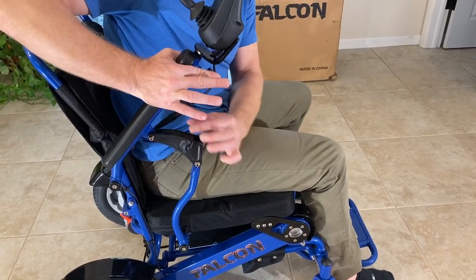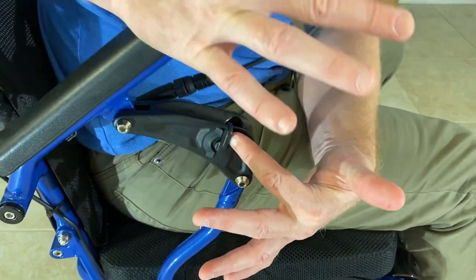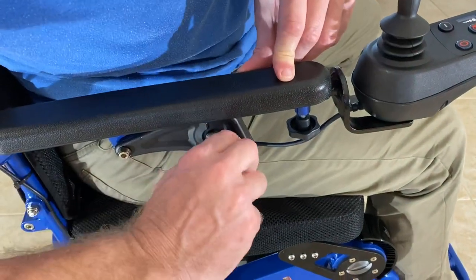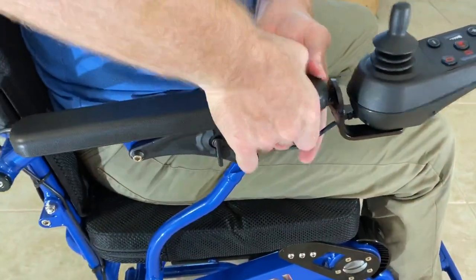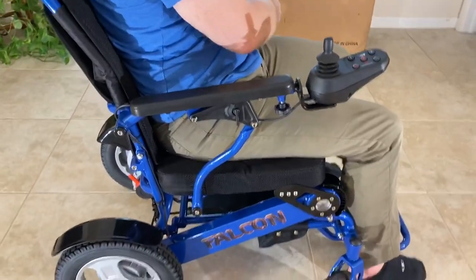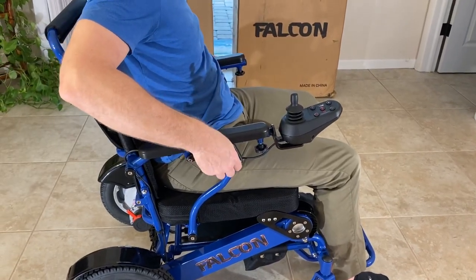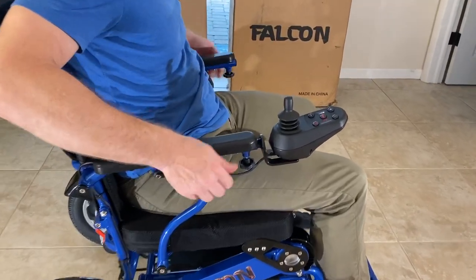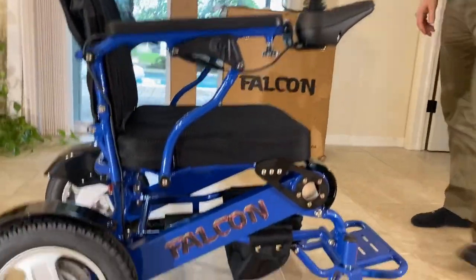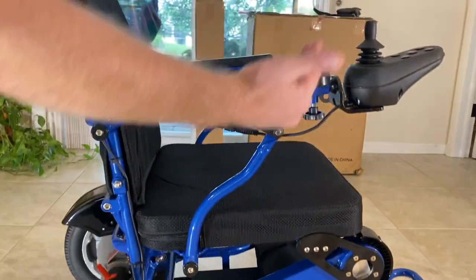This little guy slides right into place. Make certain that this lever is in the up position — this will allow you to slide the armrest in and lock it into place in the chair. Same thing on the other side: if it's blocked, turn this lever to the up position, unlock it, and then lock it. Now my armrests are easy to understand and use.